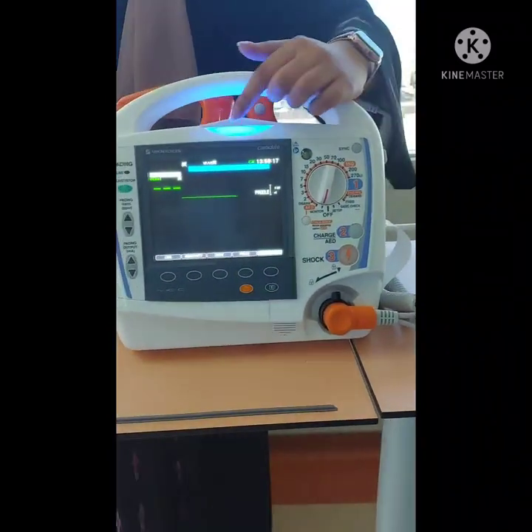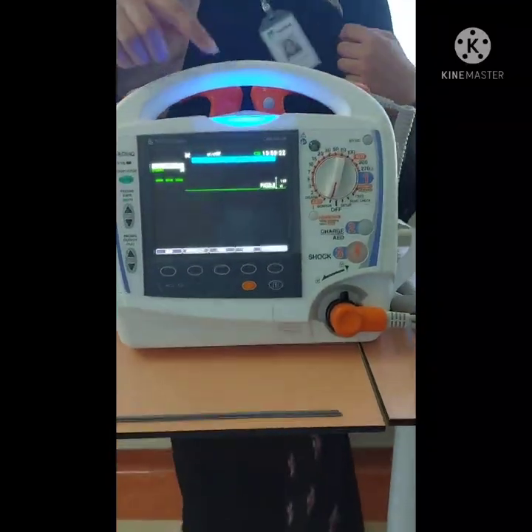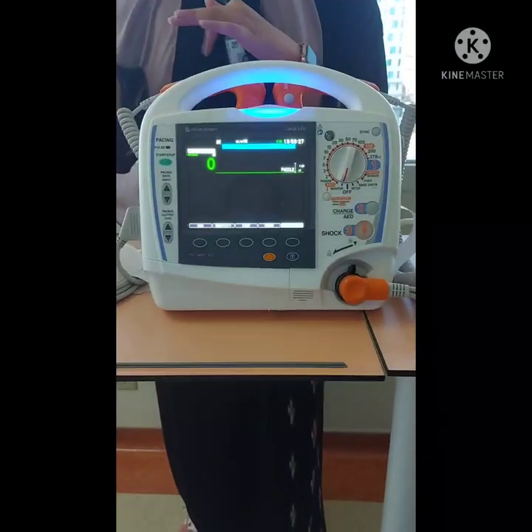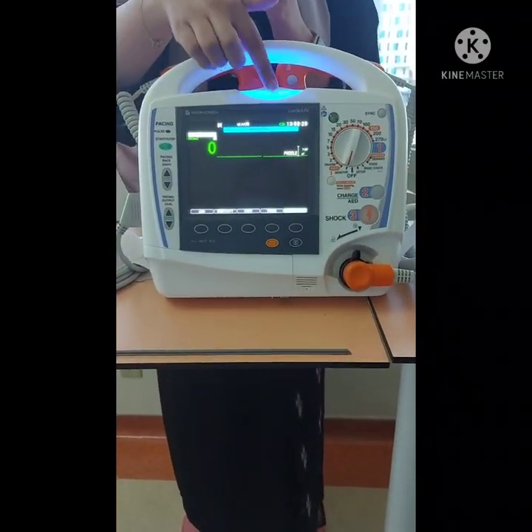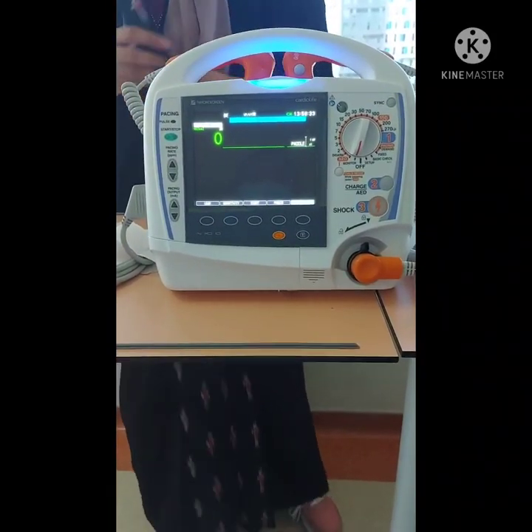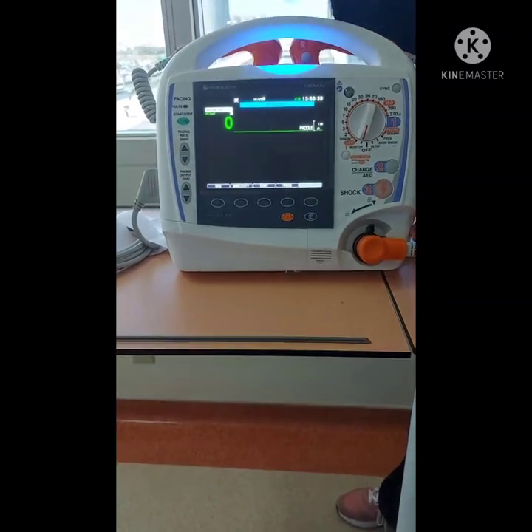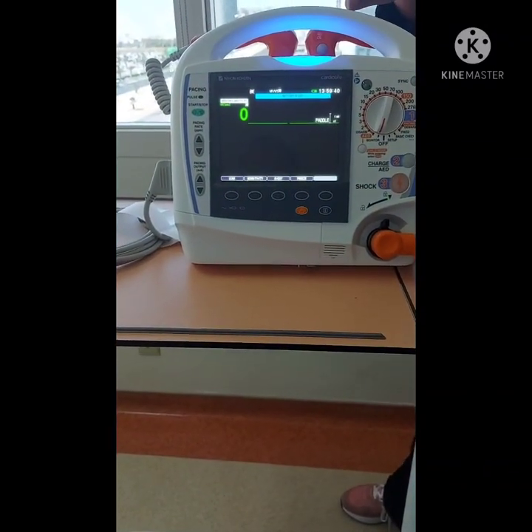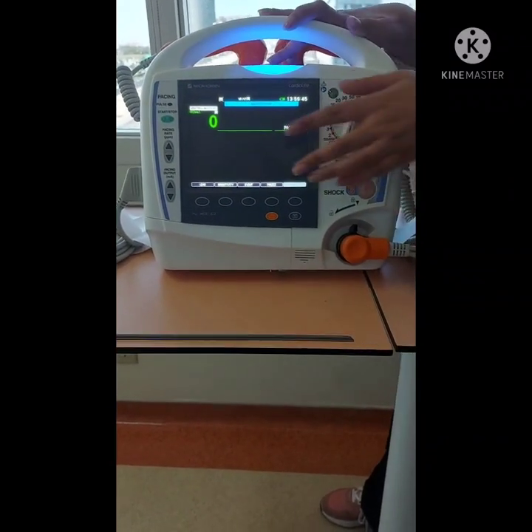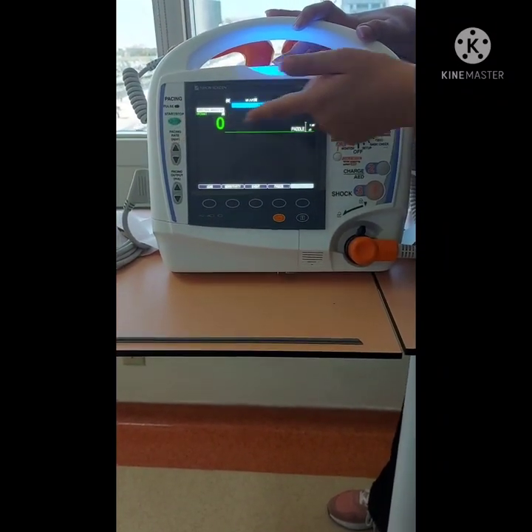Here you can see that we do have the alarm indicator, or the lamp alarm indicator. It has four different colors actually: blue, orange, red, and green if the patient status is stable. Blue is the normal, when you turn it on and it's just not connected to any patient. So if you want to put the synchronization or anything, it's not going to show you anything here because there is no waveform, it's not connected to a patient.